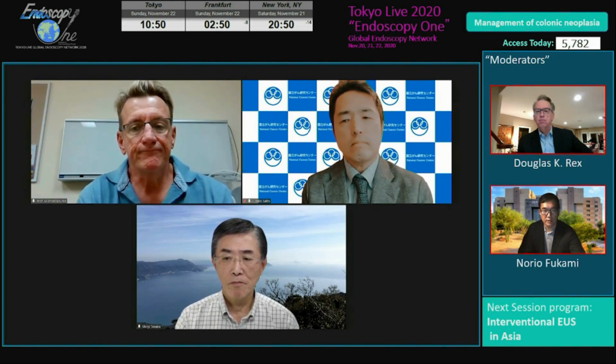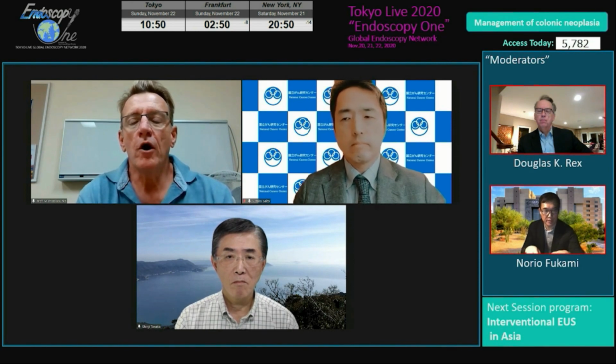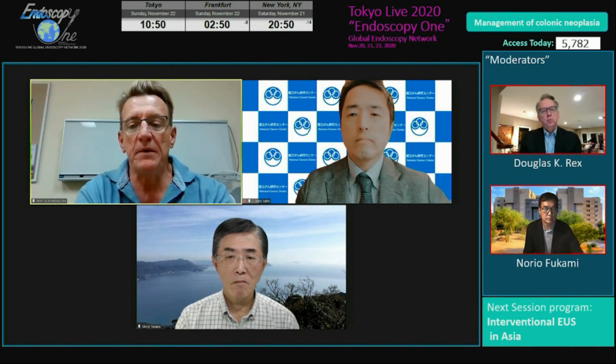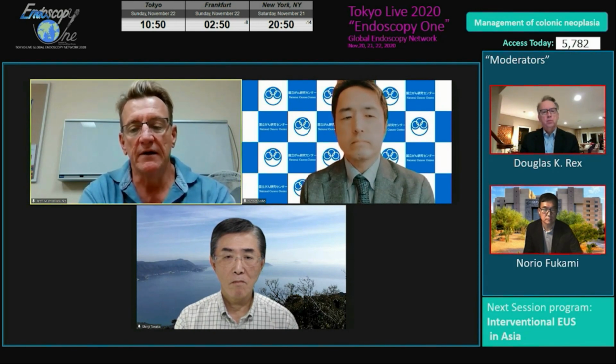Mike, could you clarify, when you do piecemeal EMR, how do you process your specimen? Do you just drop it into the jar, or do you pin it out? Yeah, so thanks, Norio. It's a good question. For the longest time, we always pinned everything that was 2 centimeters or greater. We did that for the best part of 10 years. And more recently, we haven't been as particular, but if we have a lesion that we're concerned about, we do.